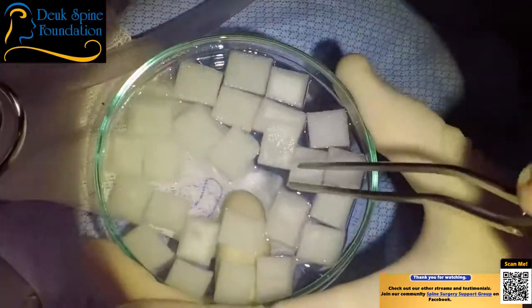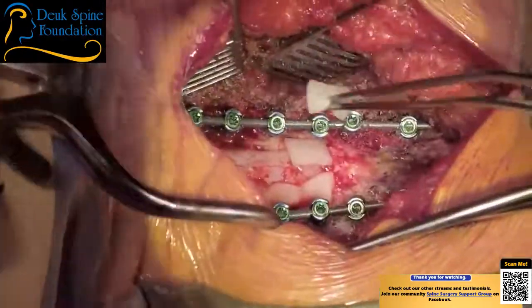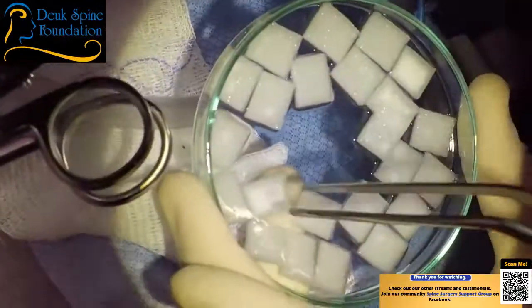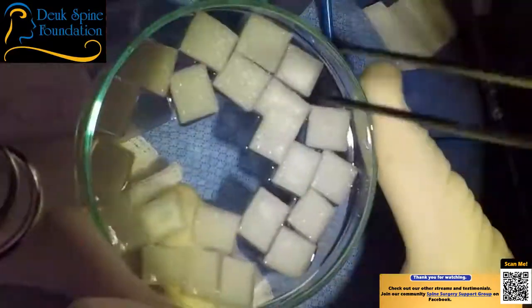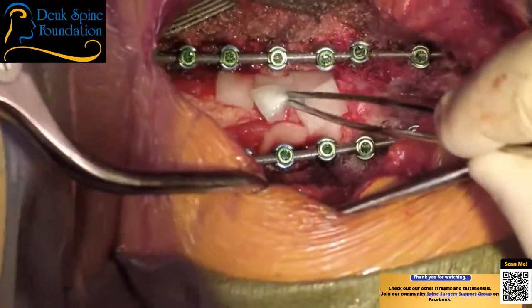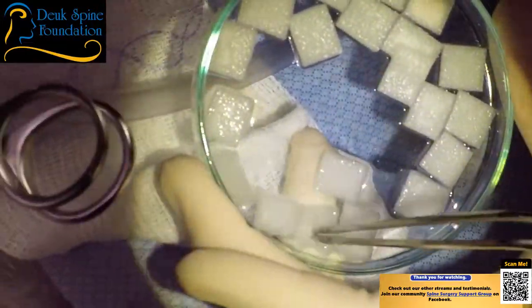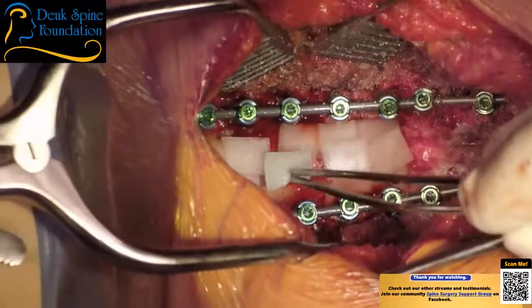Thank you. Let's see, do the other side. Just to keep the graft off the dura. Any questions from our audience? Sean? Not currently. Okay. Well, if they have questions, they know they can ask.